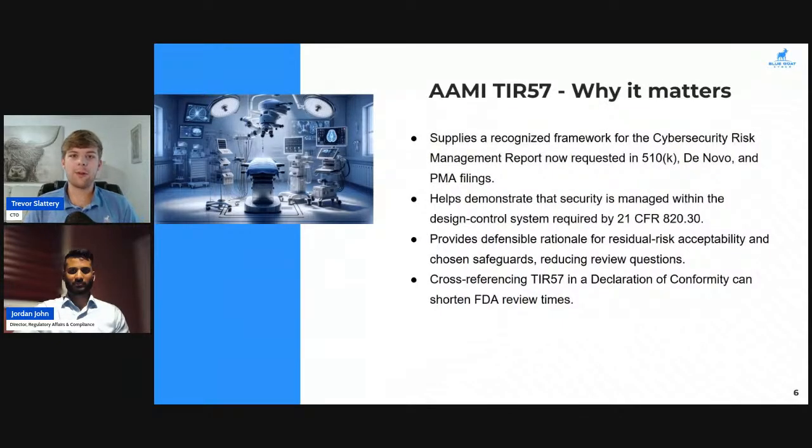All right, now we're getting into why it matters. So this is a recognized framework for cybersecurity risk management, which is requested now in 510(k) submissions, de novo submissions, PMA filings, and more. Outside of even just the FDA, this can be helpful when trying to get entered into a healthcare delivery organization. We're trying to handle something like Mayo Clinic, something like Johns Hopkins.